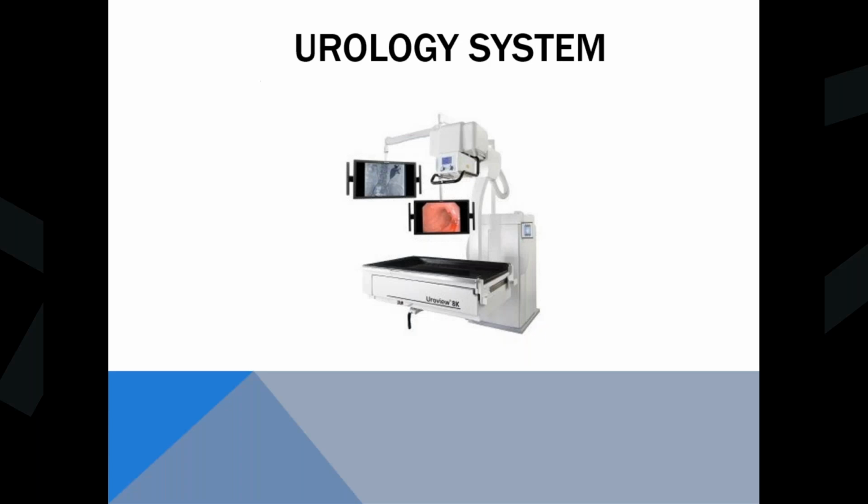Again, I mentioned earlier, urology systems are kind of a dying dinosaur. You'll still find them out there. They're a very simple system. Unlike most fluoro systems, this is actually anterior to posterior, so the x-rays come from the top, like a traditional x-ray system, and then go through to whatever the camera device is. It'll be coming through the front of the patient unless they're prone. And then you'll be able to record your images on your detector or whatever the recording device is.